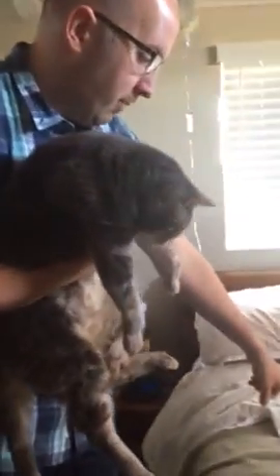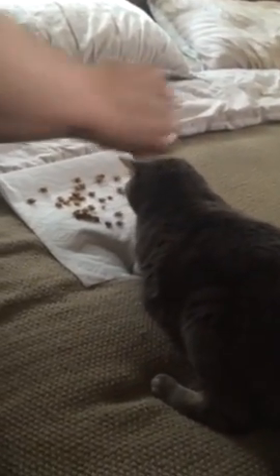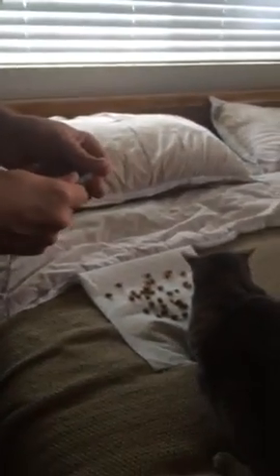I've already put out a bunch of treats for Edward. I found that the treats are a lot easier — they help keep him still while we're doing this. Usually he's pretty patient. So what I do is I put him down, and as you can see he knows what's happening. There we go — he's about ready to eat a treat. Once he starts eating, then I pull off the needle cover.